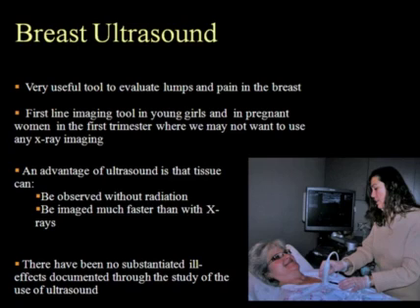Breast ultrasound is a very useful tool to evaluate lumps and pain in the breast tissue. We use it as a first-line imaging tool in young women and pregnant women in their first trimester specifically, where we may not want to use any X-ray imaging.